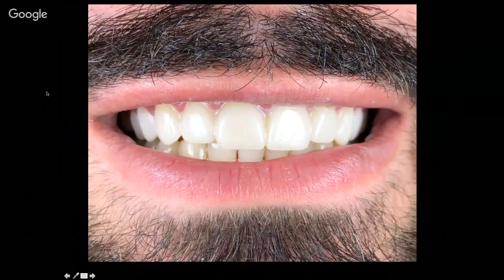At this stage, it's the step to get the patient's approval, taking into consideration all the patient's remarks, starting with the shade, then the shape of the teeth. For example, here we saw that tooth number 11 was a little bit wider and bulkier than tooth 21, so we gave the lab the instruction to make it thinner and open the embrasure a little bit to make it flatter.